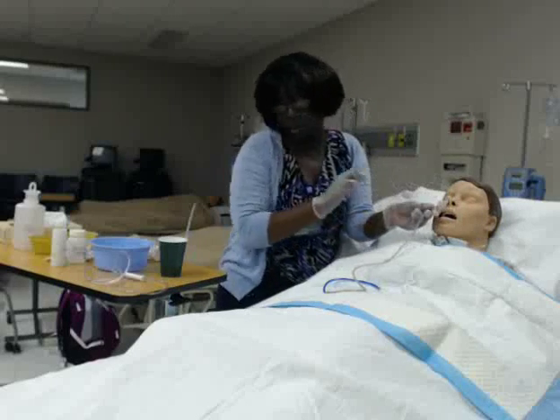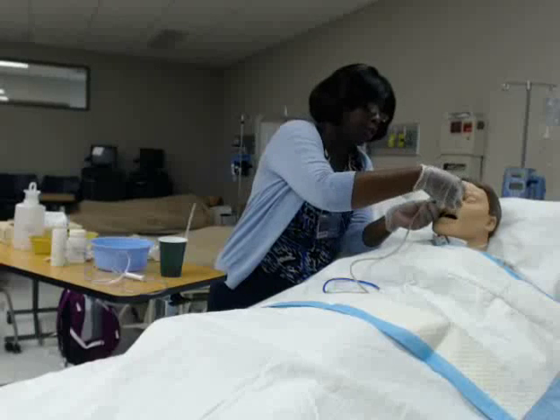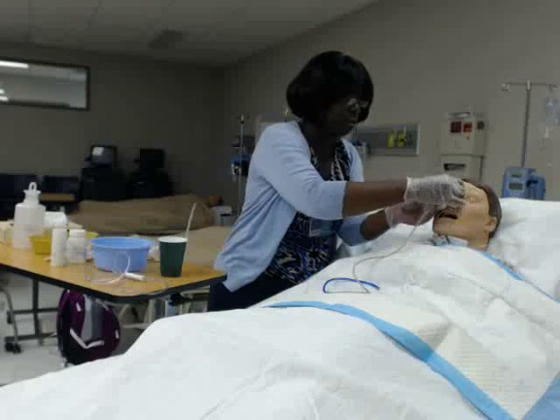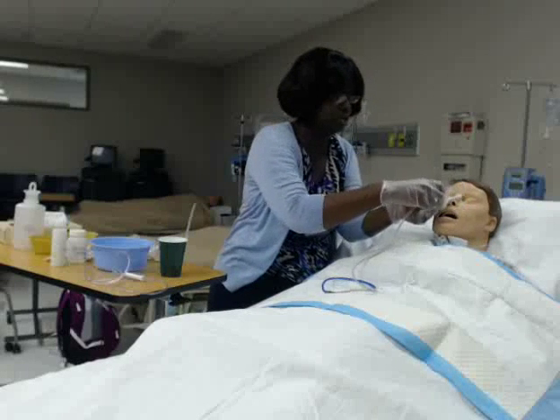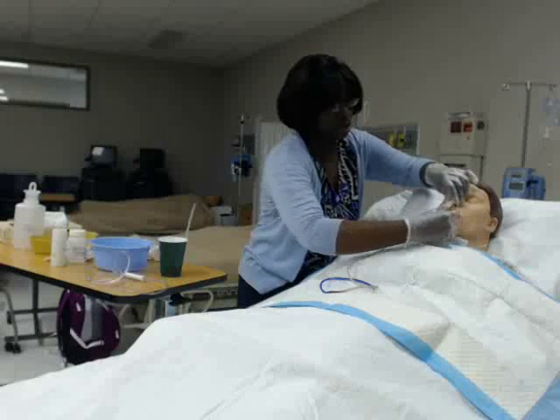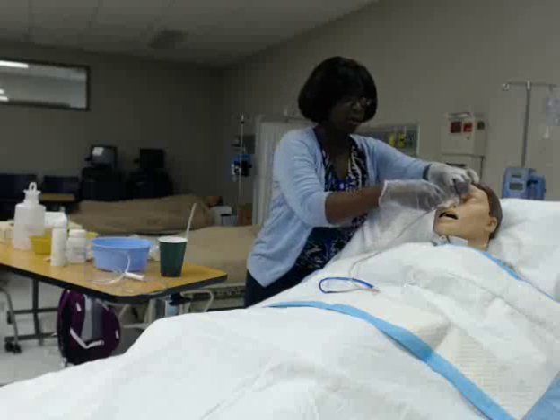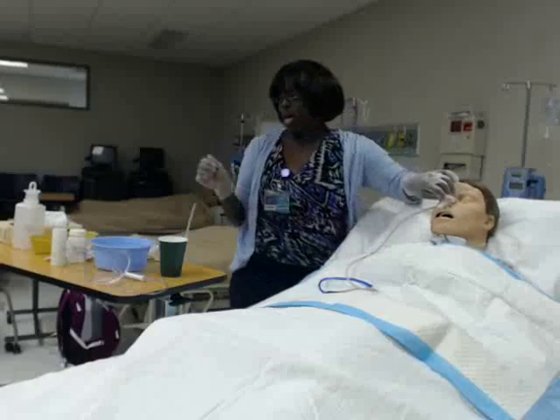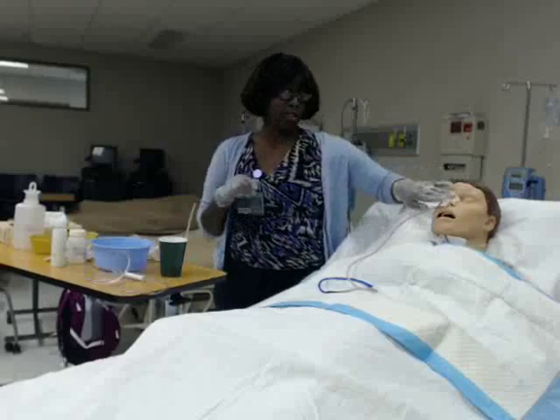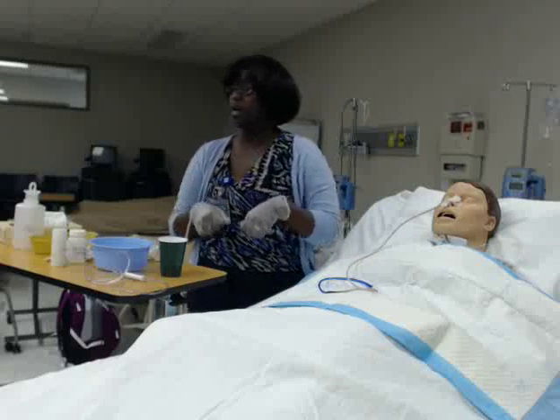This went in all the way to my spot. I want to secure this on the nose with my tape that I prepared with the little legs. The flat part of the tape goes against the bridge of the nose. Then these legs wrap up and around the tubing and back onto the nose — one leg comes down, around, and up; the other comes the opposite direction. Sometimes we can use a skin prep adhesive wipe to help the tape sit. A lot of facilities now have self-adhesive nose pieces that come pre-packaged, but sometimes we tape the old-fashioned way.